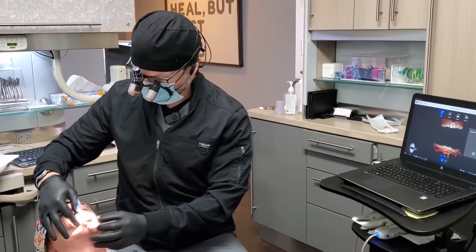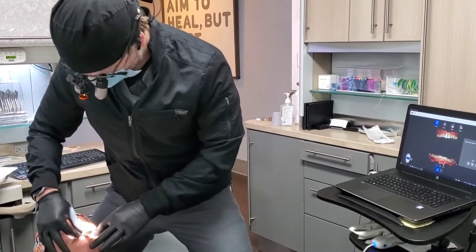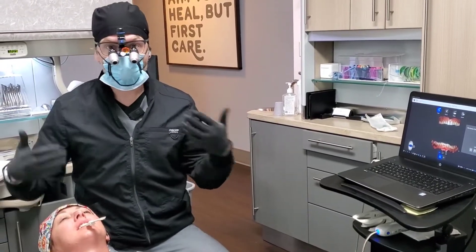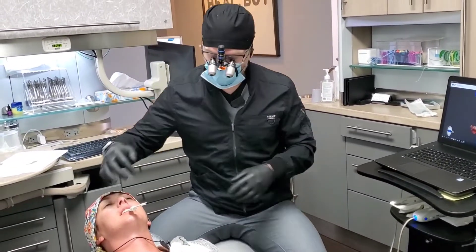Now just hold that there for a second. I'm checking to see if she's got enough disclusion — and she does. Maybe even a touch more than necessary, but I think I'm going to go with that. So she's just going to hold on to that, and her job is just to hold still. I'm going to be pulling her cheeks out of the way — you want to communicate that. Even though I moved your cheeks, hold your teeth still.